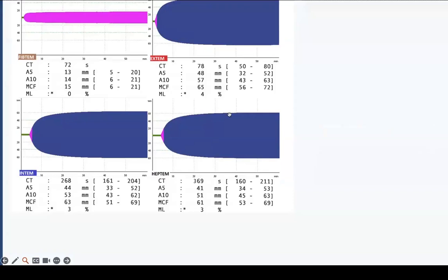Okay, now the patient is being given protamine. This can be due to protamine effect. All right, how do you know? Clotting time in INTEM does not get corrected in HEPTEM. That means even if you take away the effect of heparin, still the clotting time is prolonged in HEPTEM. What can do this is protamine. So this is protamine effect.